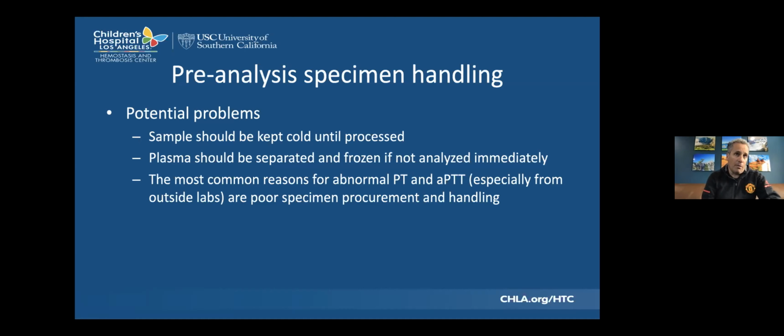So if it's coming from another hospital or from an outside lab, keep in mind that you may get false samples. Now, I realize that for this particular audience, it's not so much of an issue, but if you are seeing patients in a clinic or outpatient setting, and you're getting a sample from Joe's lab next to the 7-Eleven, this may be a problem where the sample just sat there all day until the courier came and then he brought it to the lab and then it sat in the receiving area. So keep in mind that really these should be kept cold.